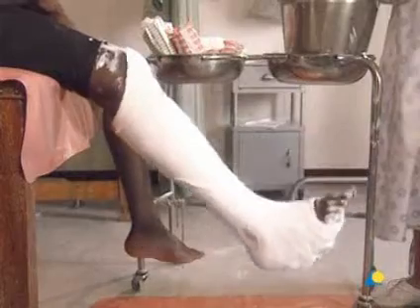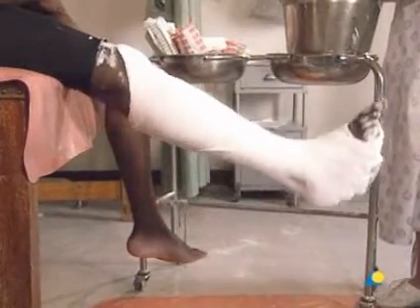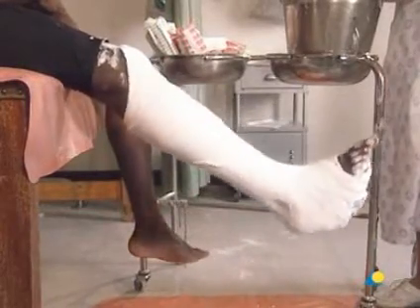The application of the PTB, or patella tendon-bearing cast, is now complete.